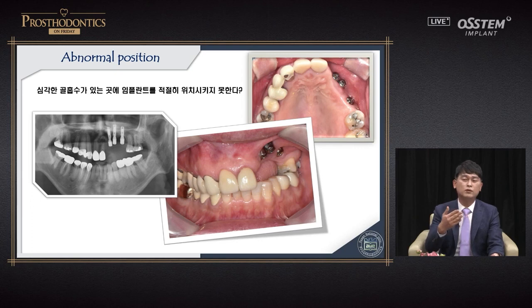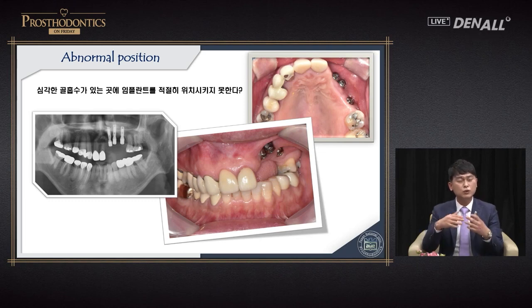A male patient in his 40s came to us from Daegu. The dentist who placed implants, I believe he had no choice because the patient wanted implants in an area where no bone was available. What would happen to this patient? Fixed prosthesis continuously failed, food impaction continuously occurred, leading to peri-implantitis and pus came out. He came to me like this after peri-implantitis treatment in the perio department.